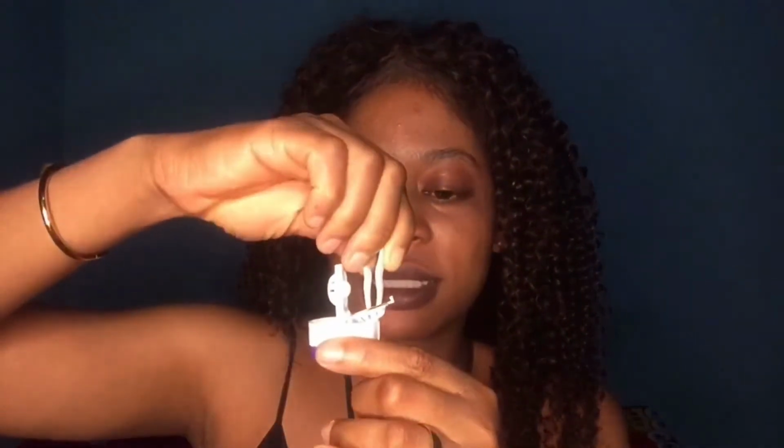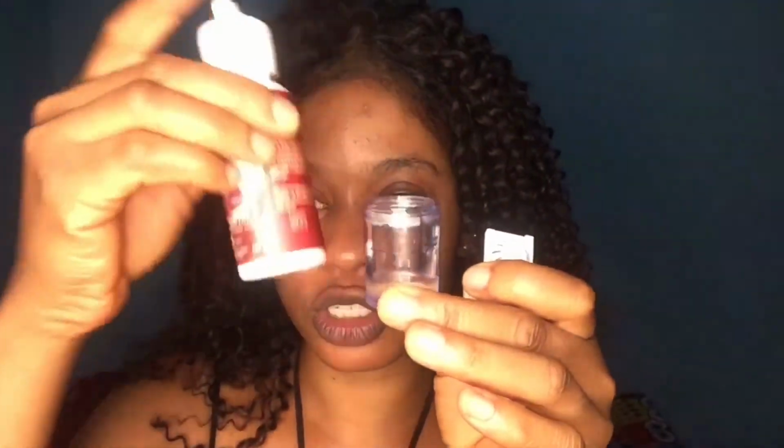Now this contact lens washer, I know you'll be asking where you can get it. I bought mine from Jumia. I think cosmetic stores should have it, but I bought mine from Jumia. So after putting the contact lens on this, as you can see, I've closed it. Then you pour your solution into this cup and close it.